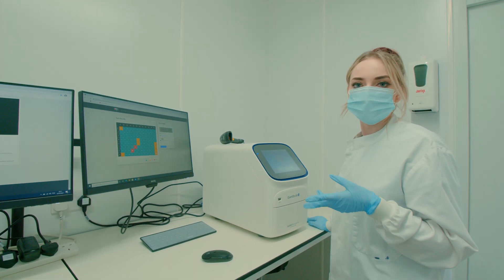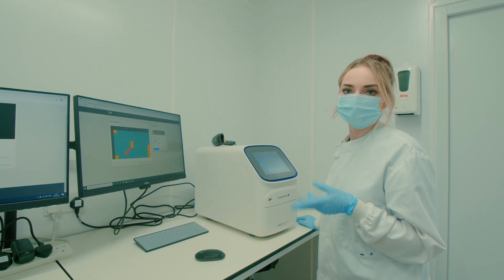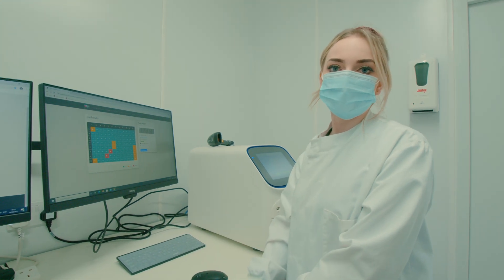When it's done, either the presence or the absence of viral RNA will dictate whether the result is a positive or a negative. This is then sent to our software and sent back to the patient.